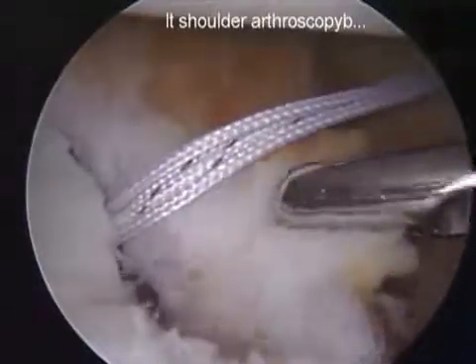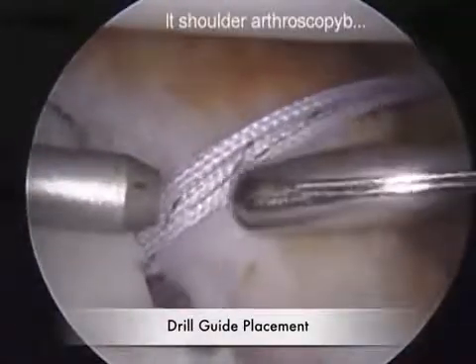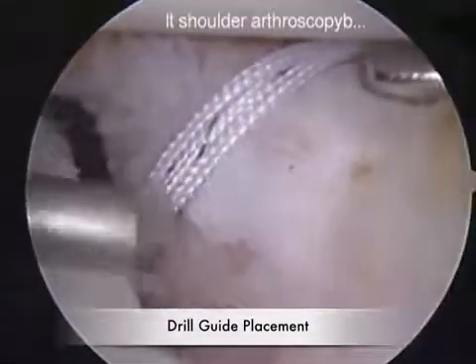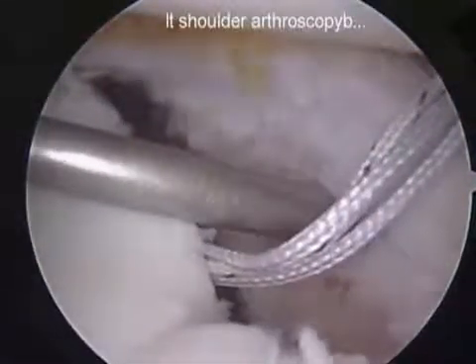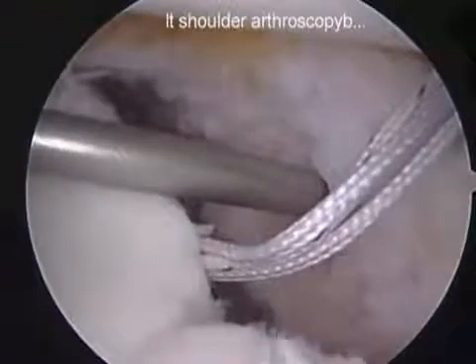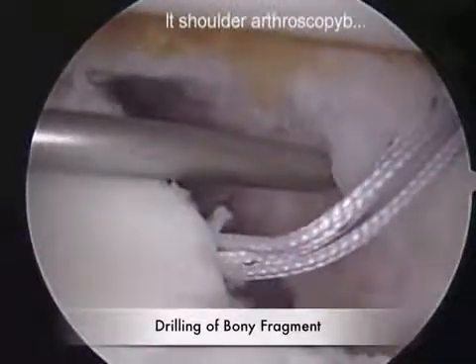The fragment is again mobilized in preparation for drilling. A long drill guide is brought in from the posterior portal. Care is taken to ensure that the drill holes are at the same depth as the anchor in an effort to achieve an anatomic reduction of the bony fragment.